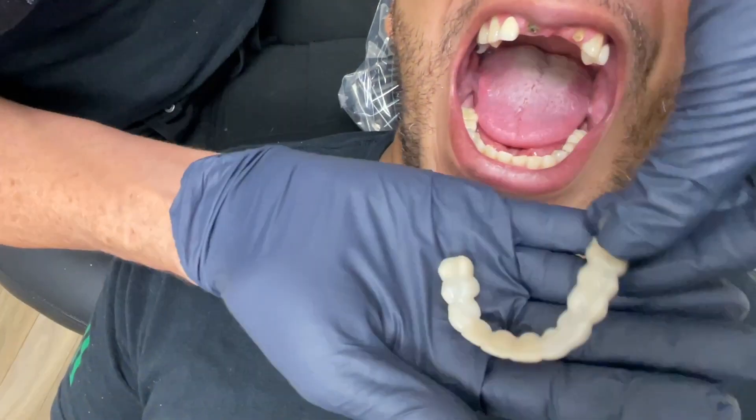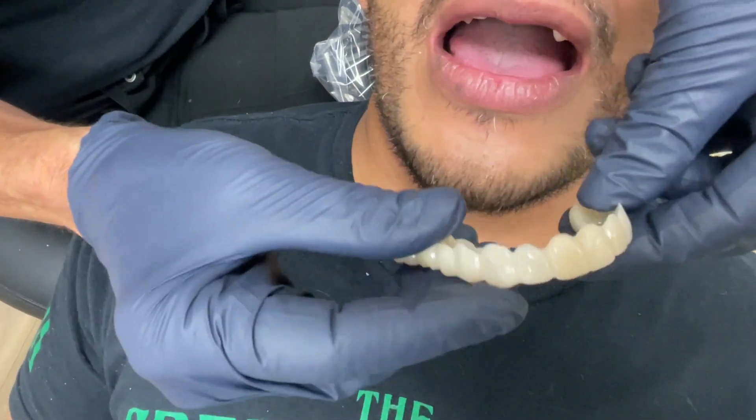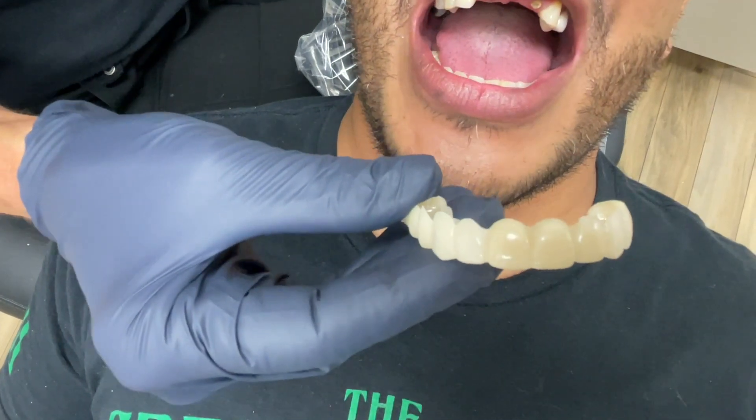It's really bulky, and I can see it comes right off. It comes right off. Okay, so let's look at the Snap-on Smile. Here is the Snap-on Smile, and you can see it's much more contoured and this thing fits like a glove.